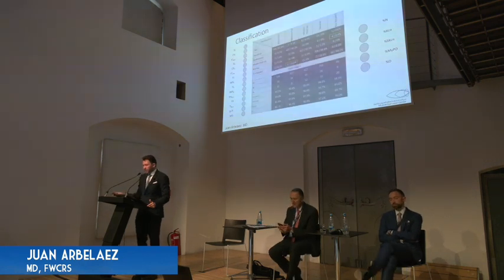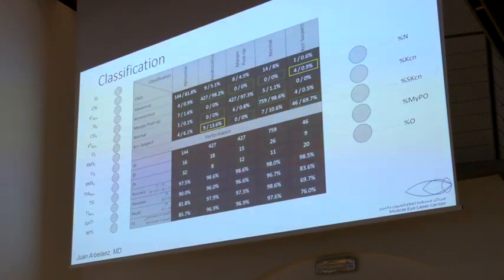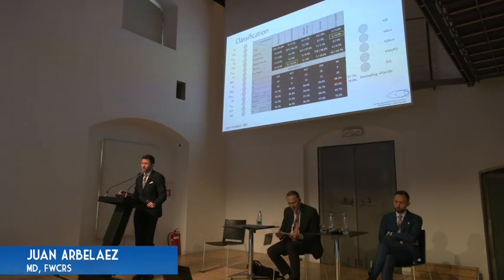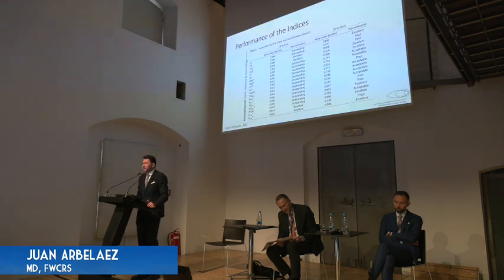So what did we achieve with this classification? Previously, with the Sirius software, with the Sirius screening without using artificial intelligence, we had 97% and 78% accuracy, which went up to 98.5% and 83.6% using now epithelial data and a neural network involved in our screening. So how do the indices perform?